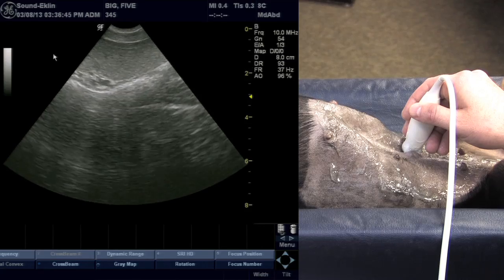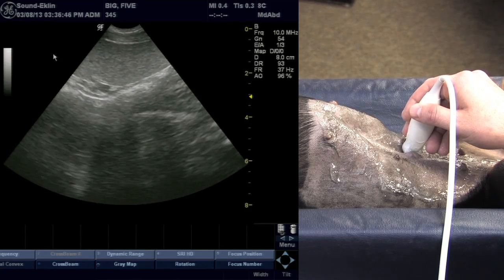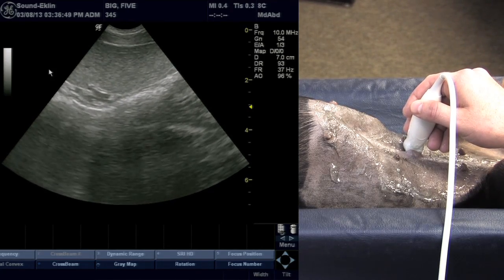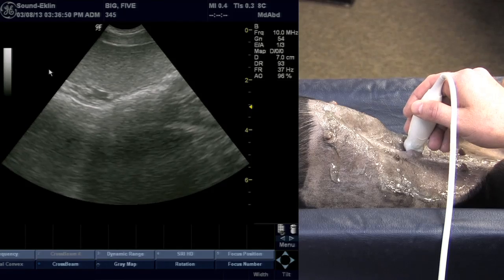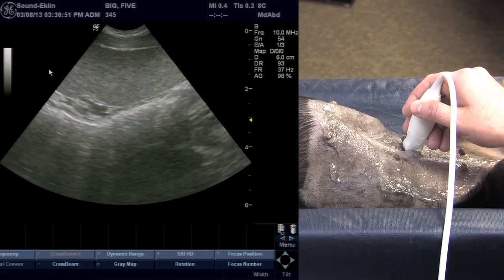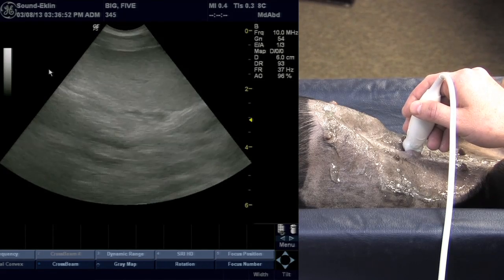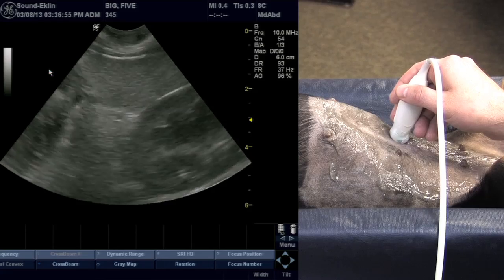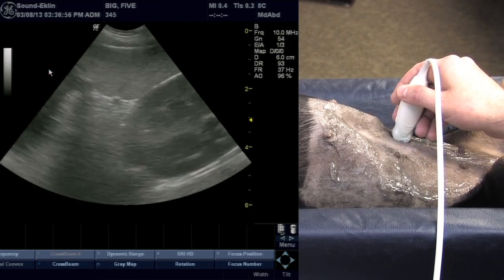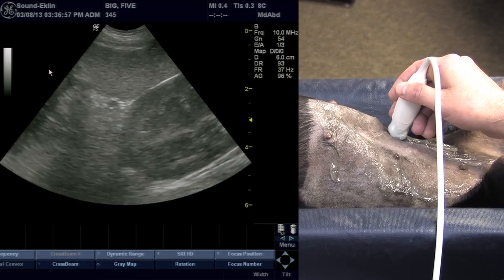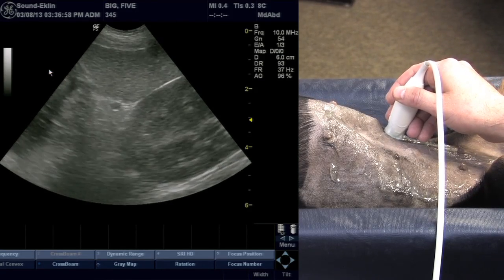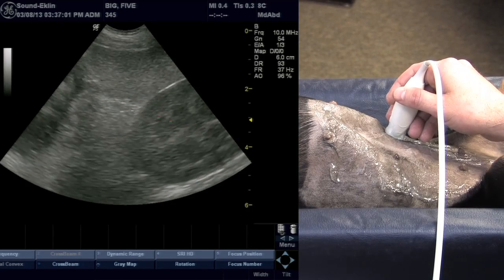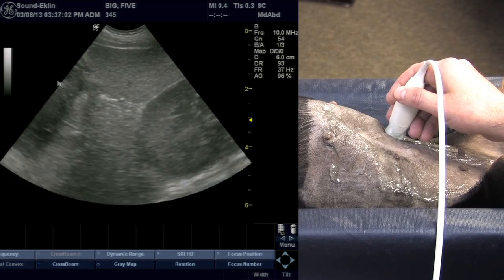At this point I'm going to adjust the depth. This is a shallow structure and I don't need as much information on the screen, so I'm going to make the depth more shallow so that we can focus on the spleen. We'll repeat that motion starting at the body or junction of the body and the head of the spleen.